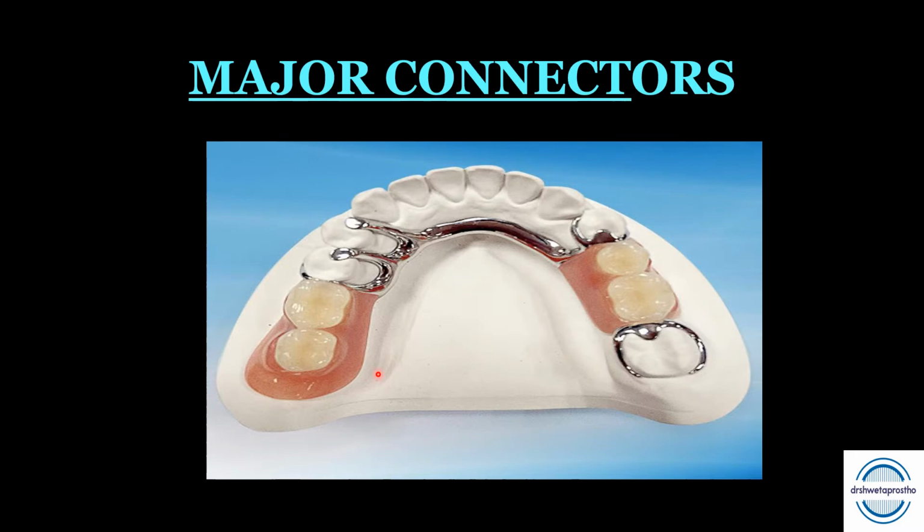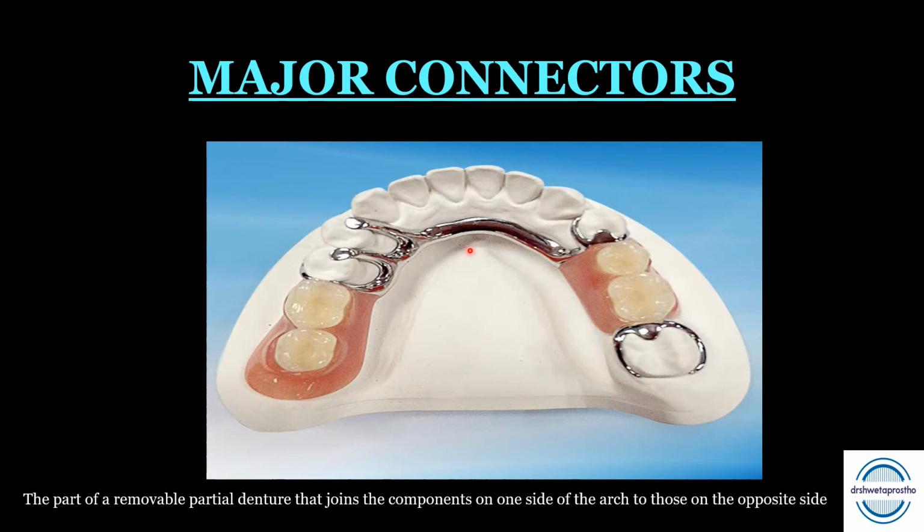Now, what is a major connector? Major connector is the part of the RPD that joins the components on one side of the arch to those on the opposite side. So this is the major connector.